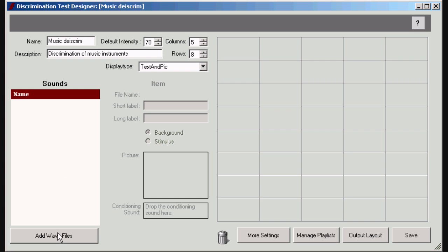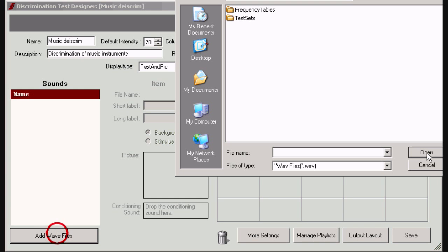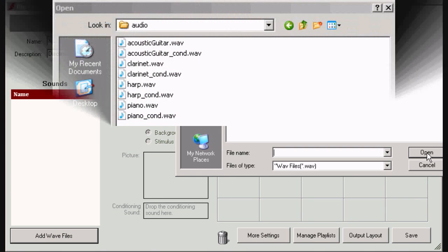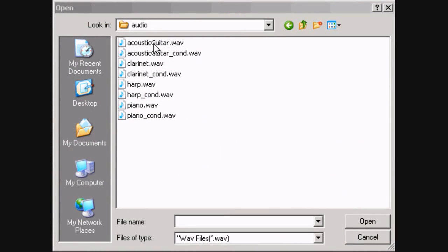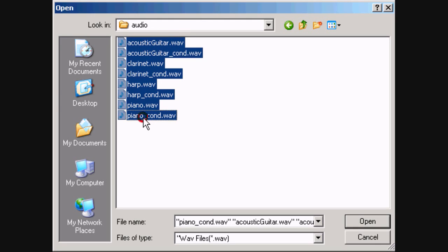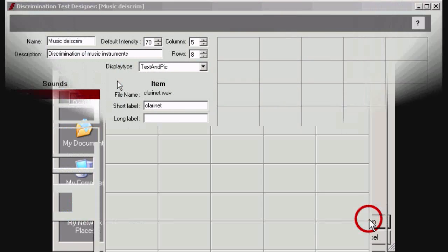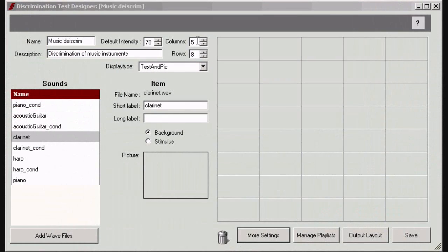Add the WAV files you want to include as test items. It is of paramount importance that these files have been calibrated against the ACE calibration file. More information can be found in the ACE manual and help function.